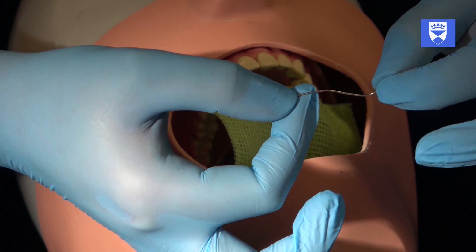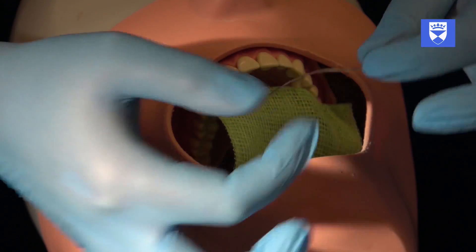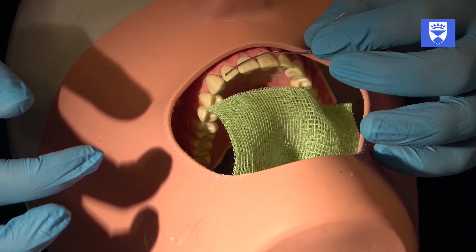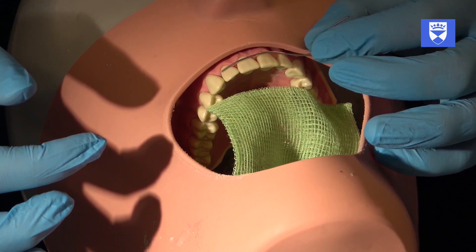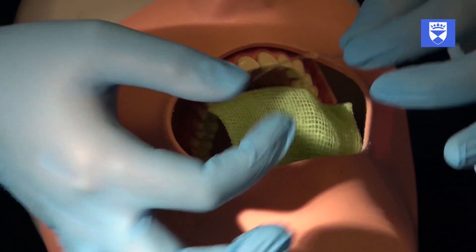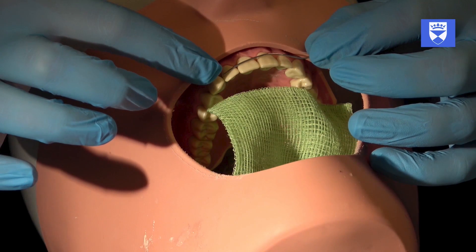Holding the safety handle, position the wire in the mouth with one end over the midpoint of the right lateral incisor. Adjust the splint length until the end points lie at the middle of the adjacent abutment teeth. Curve the wire to match the curvature of the maxillary arch — the splint should lie passively over the teeth. Pre-accident photographs may help decide the exact shape of the splint. We now test the splint against the teeth holding it with the safety handle.